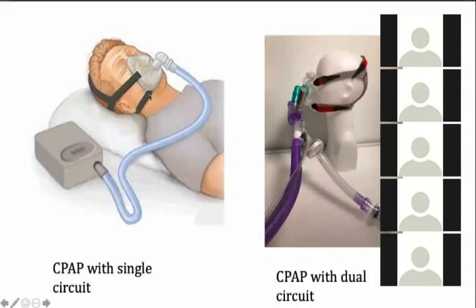And the first device, sometimes patients have them at home and they sometimes use them at night. You might have heard about these things, isn't it? You can see that this mask is very tightly attached to the patient's face, with straps and harnesses, and these masks are extremely uncomfortable. Generally, patients do not like them. So that is one of the major disadvantages of this technique, but they improve oxygenation and can be used to improve ventilation as well. That is why we like these gadgets. It doesn't mean that the patients have to like it, no.